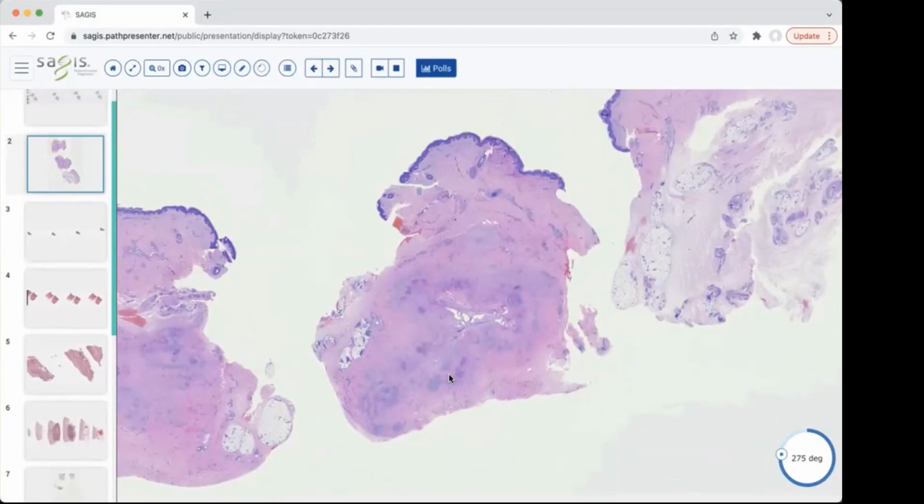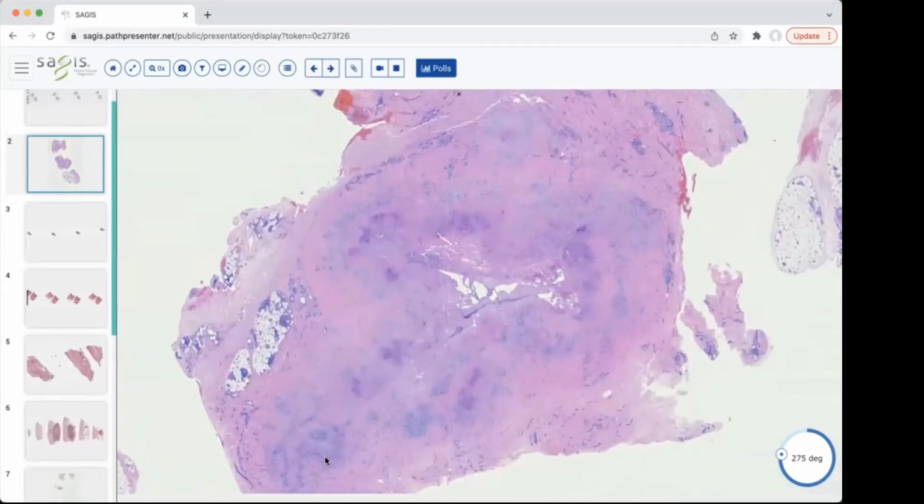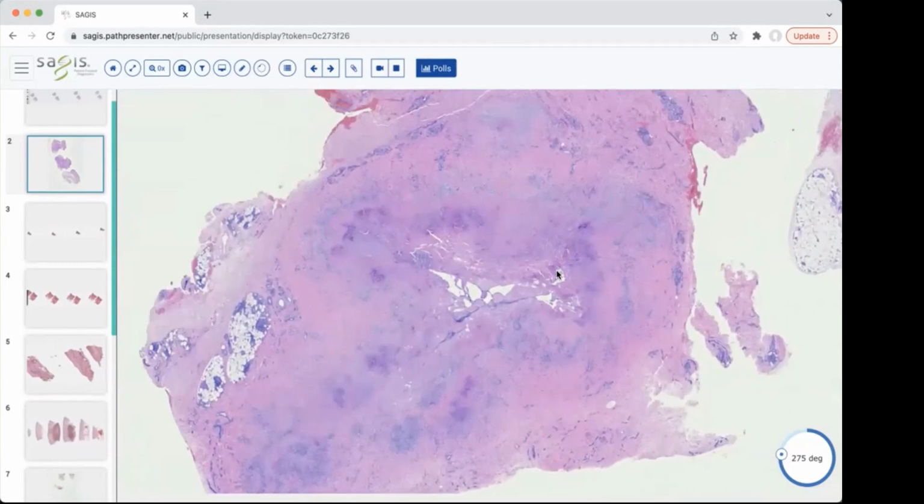You may even think about some sort of tumor, but as you come in a little bit higher, you can again see this sort of walling off, this fencing, palisading of cells. And again, there's degenerated collagen here in the center, but it's more of a magenta or hot pink red color rather than that blue that we were seeing previously.